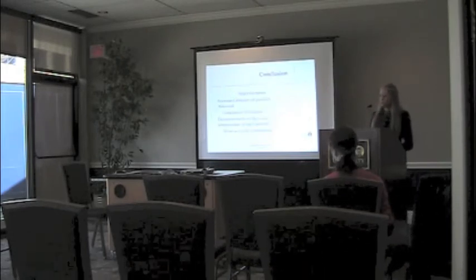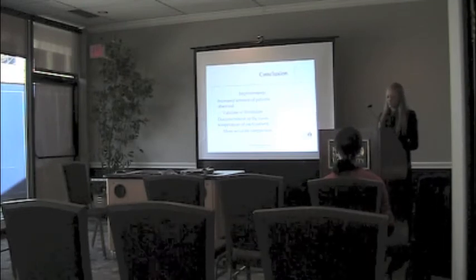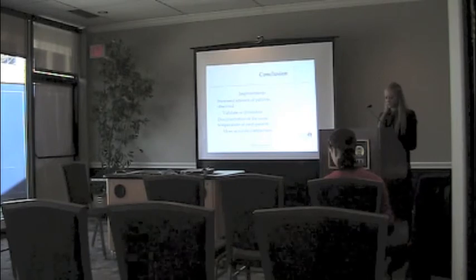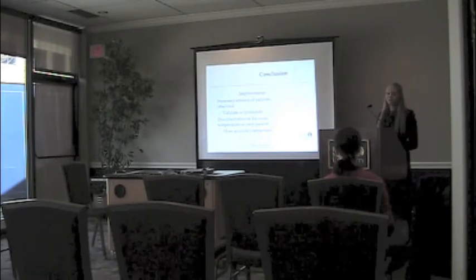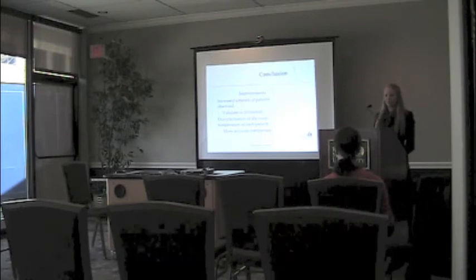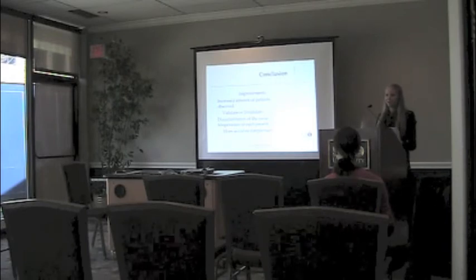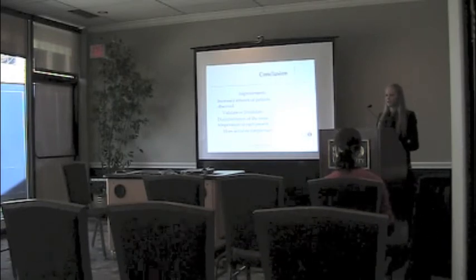As for improvements I would make on this research, an increased number of patients would definitely help validate or invalidate more variables more strongly. Looking back on it, knowing that patients wait between 45 minutes to an hour between injection and scan time, maybe 45 minutes compared to 60 minutes in a warm chair with a warm blanket in a warm room would affect that, because we do know that it is affected by temperature.